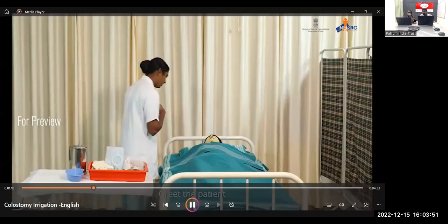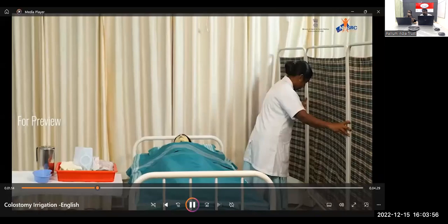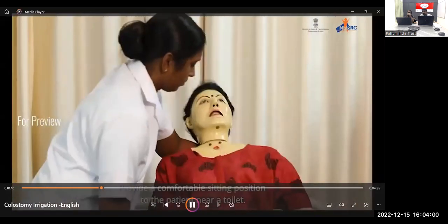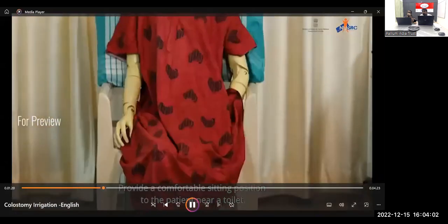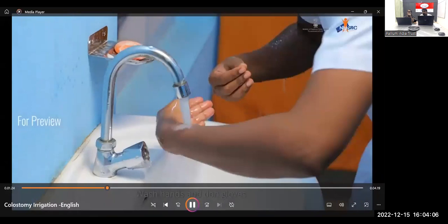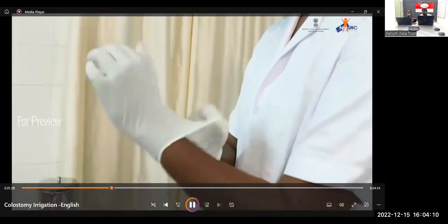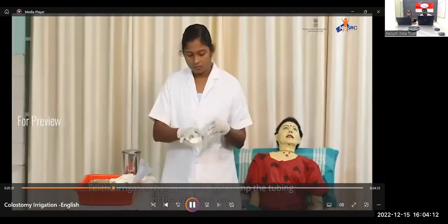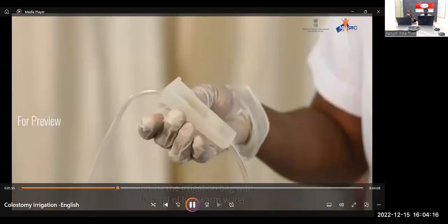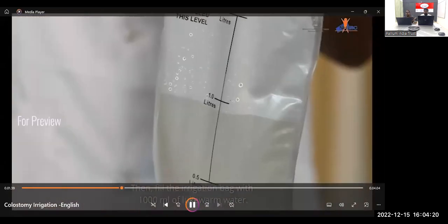Procedure. Greet the patient. Explain the procedure to the patient. Provide privacy. Provide a comfortable sitting position to the patient near a toilet. Wash hands and don gloves. Fill the irrigation bag. For this, first clamp the tubing of the irrigation bag. Then fill the irrigation bag with 1000 ml of lukewarm water.